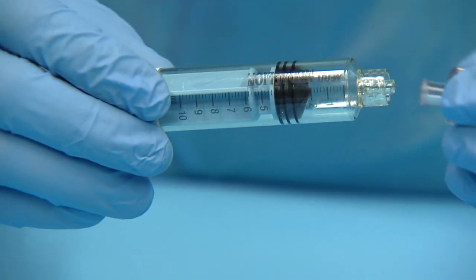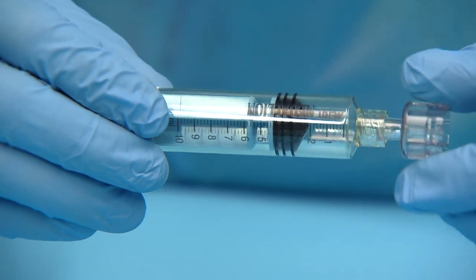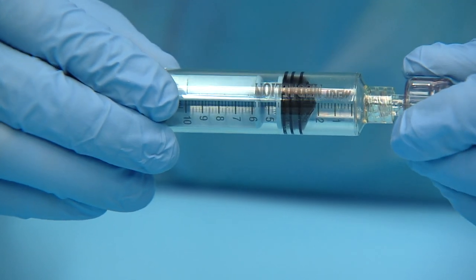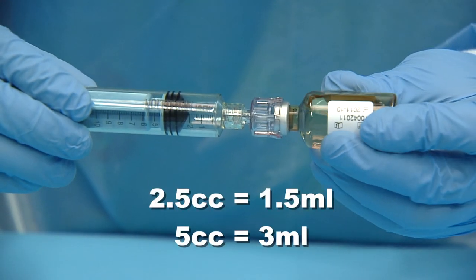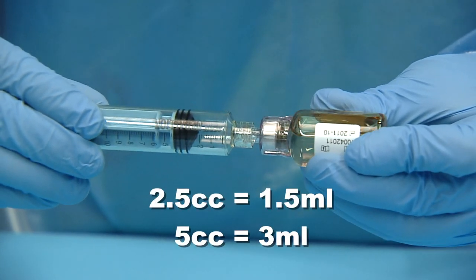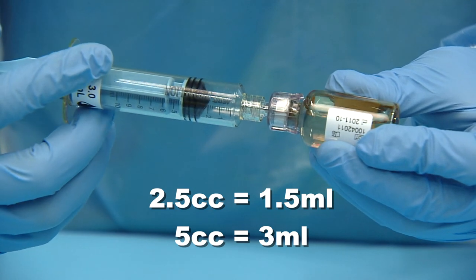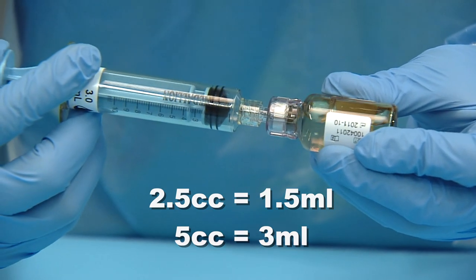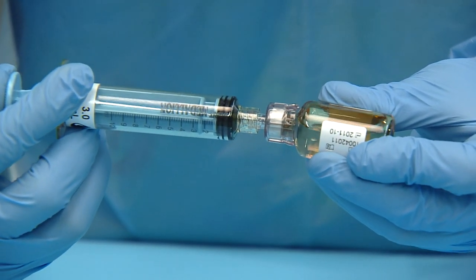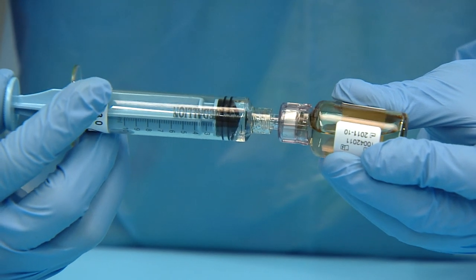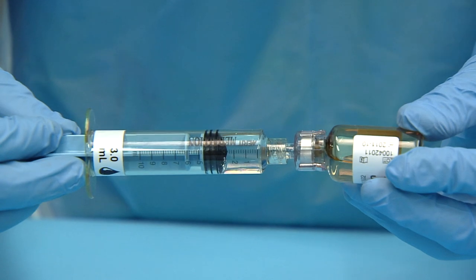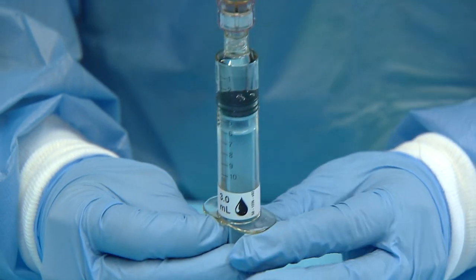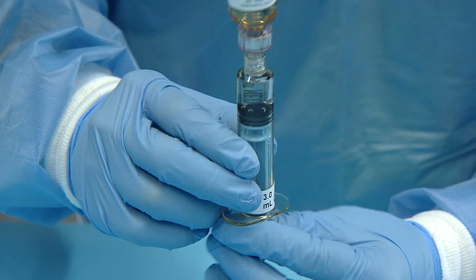Withdraw the appropriate amount of saline given to you on the package using the supplied syringe and vial adapter. When withdrawing the saline, be sure to measure it using the tip of the plunger and make sure there are no air bubbles by retracting and pushing the saline in and out until air is gone.